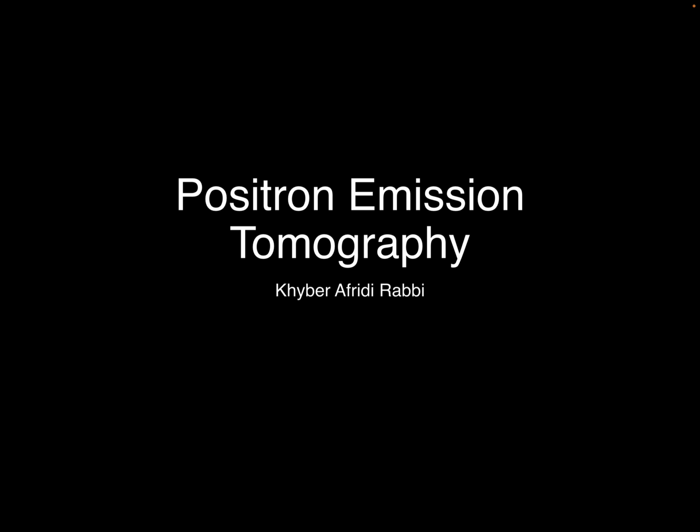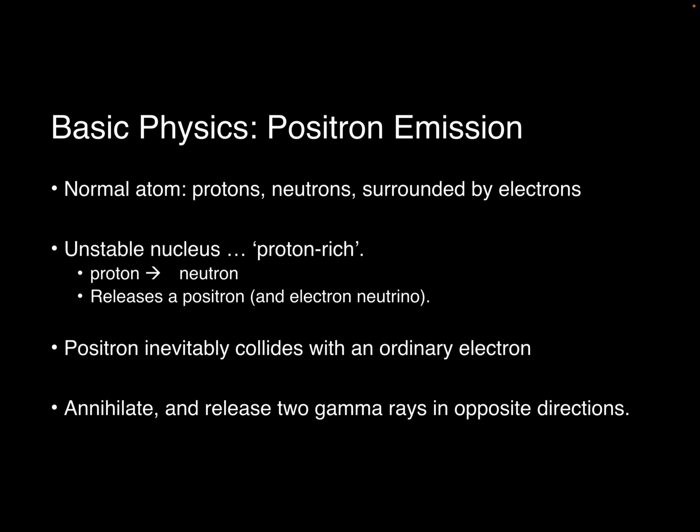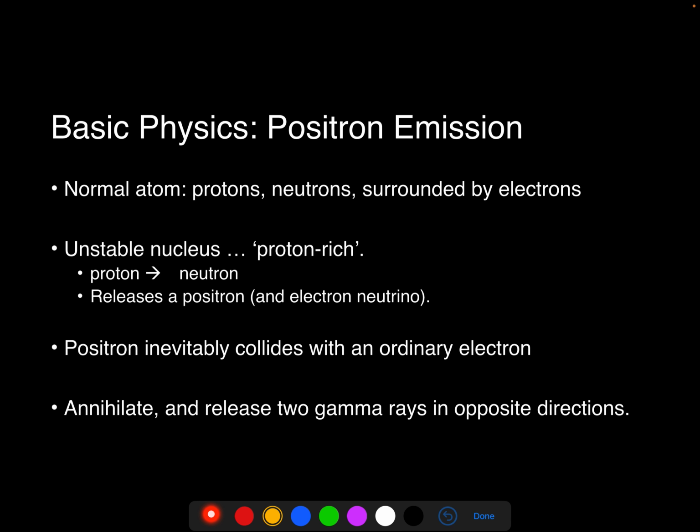Hello everyone and welcome to our video on positron emission tomography, which is a type of scan. First of all, I'd like to cover a bit of basic physics, particularly positron emission.